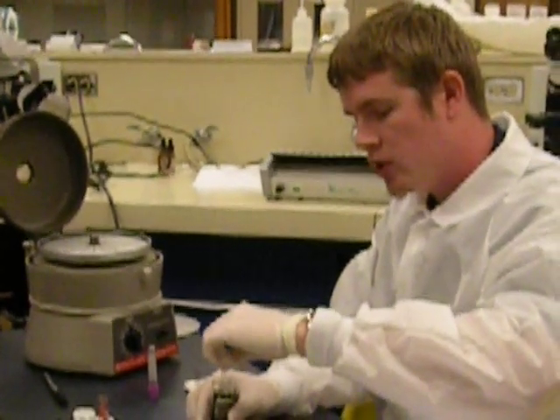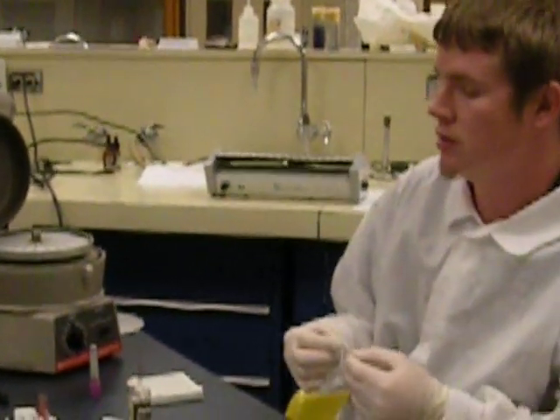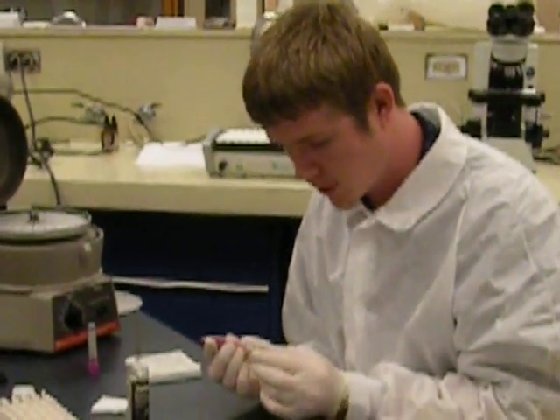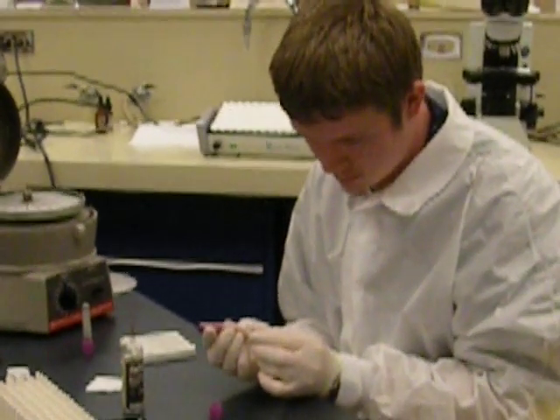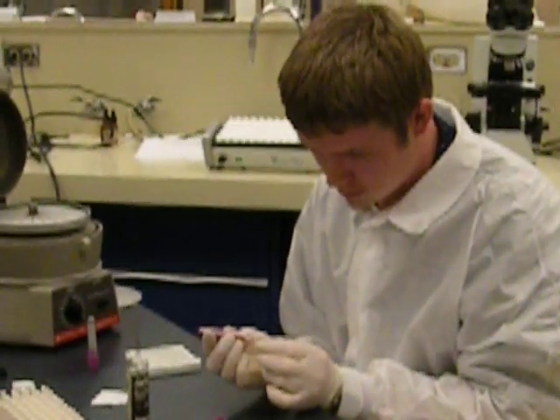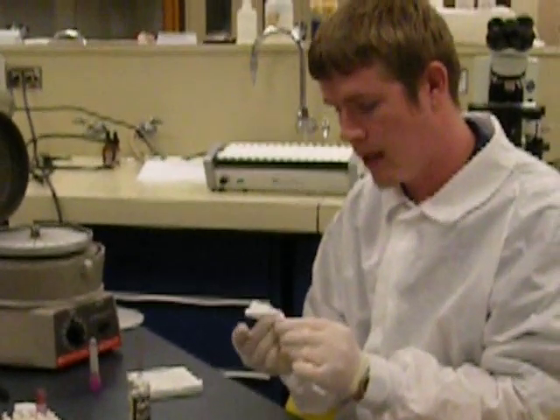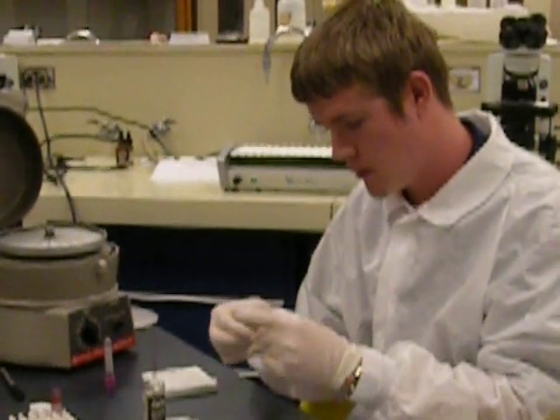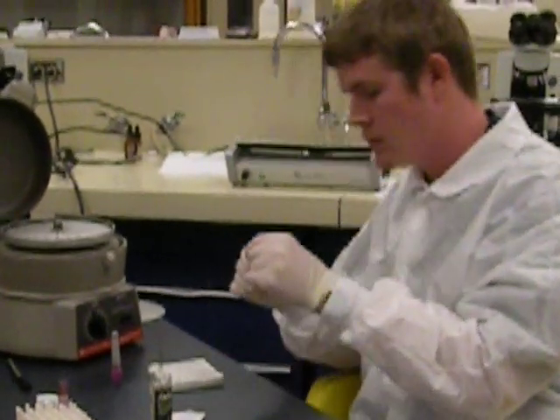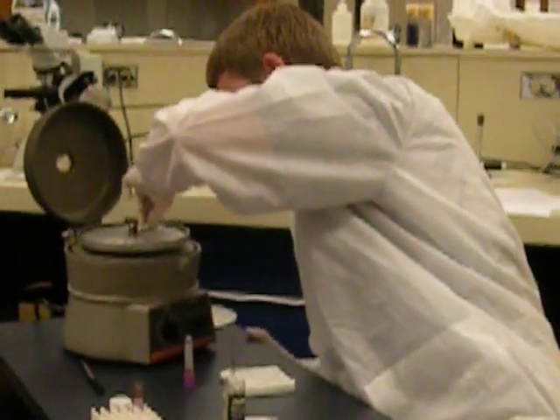When you're doing a spun hematocrit, you want to make sure that you do it in duplicates in case you need to redo it — you need to have consistent results. So we'll go ahead and make a second one. You're going to want to wipe off the outside and cap the end that you didn't have in the vial, so as to not contaminate the clay. We'll put this one in slot 3, opposite from the first one, to keep it balanced.